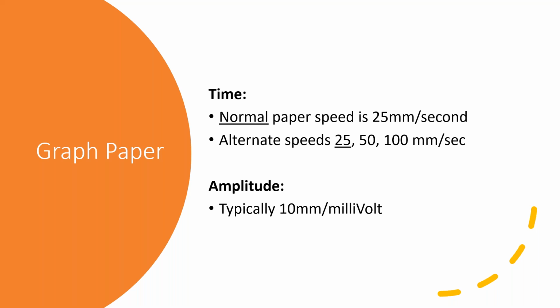Oh, what's in the EP lab? Yeah. So they can look at it more closely, what's happening during each part. Yeah, kind of. So she said that in the EP lab, with different systems, they sometimes extend the speed out a little bit more so they can look at it a little bit better, kind of like what I said.